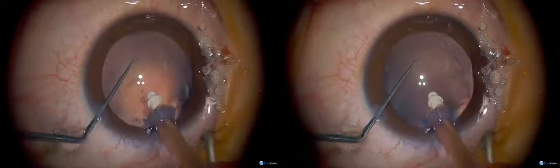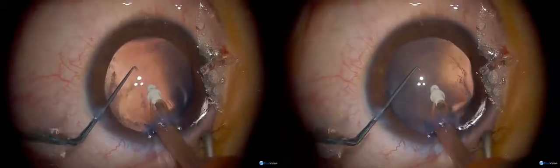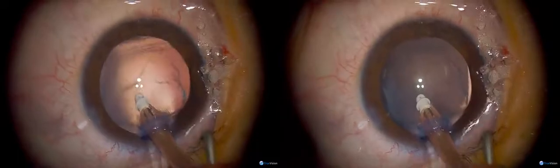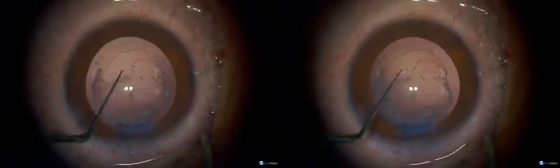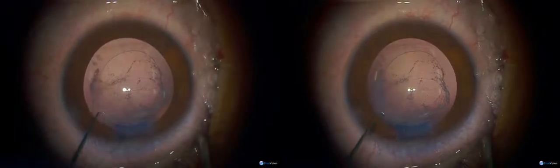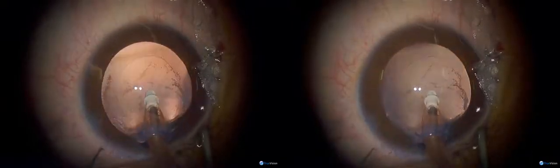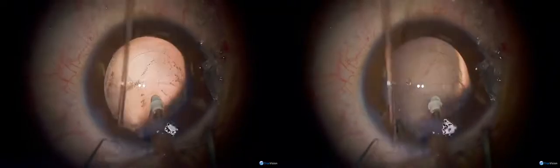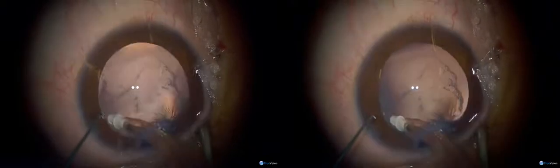That may be the posterior capsule that's broken there, and that may be the anterior hyaloid face behind it. A question from the classroom about the membrane and whether I'm going to leave it or take it out. I think that line there is a tear in the posterior capsule. This is the posterior capsule here, and underneath is probably the anterior hyaloid face of the vitreous — so that explains why he's got a cataract. I'm going to put a lens into the bag.